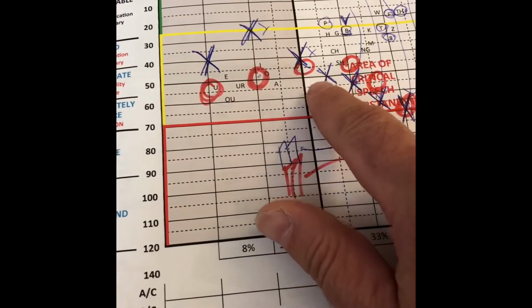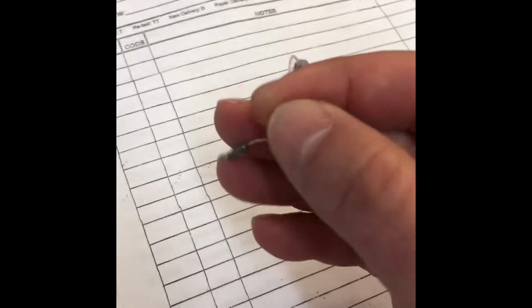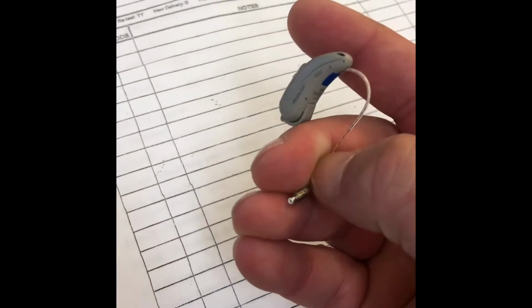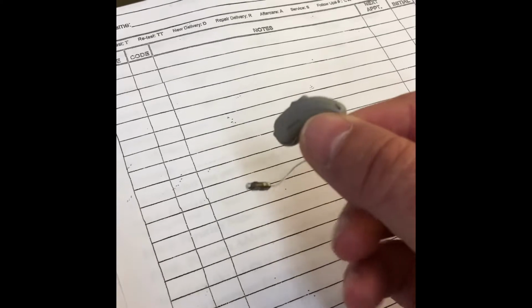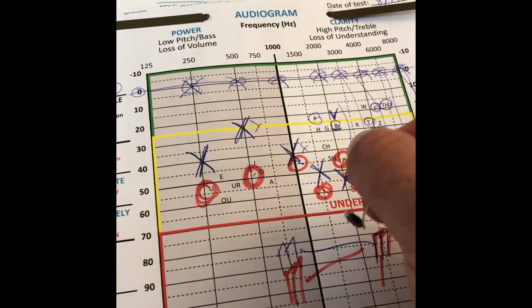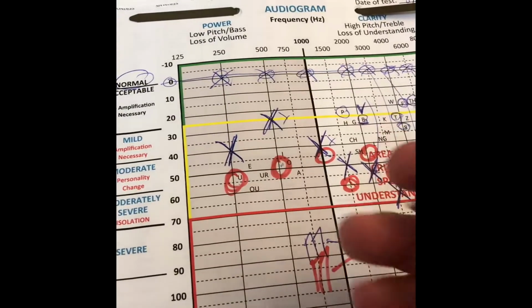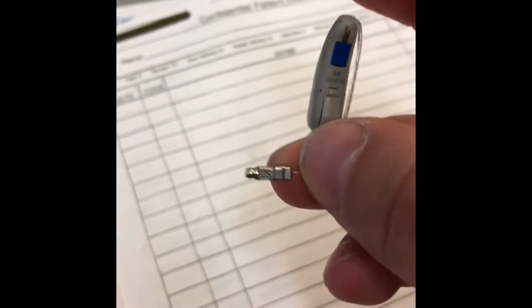The problem is her ear canal is very, very small. We first went with the RIC, with a small dome because her ear was so small, an S receiver, and a concha lock to help it stay in. It was working for her hearing, and I'll show you why in a minute. Even though it's not fully sealed, because of the size of her ear canal, it acts as if it is sealing the ear more, so it's still considered an occluded fit.